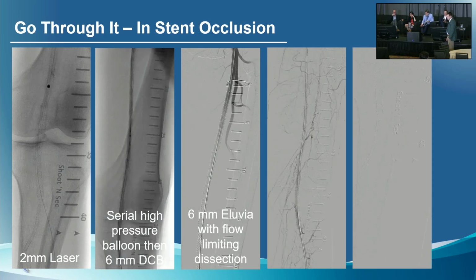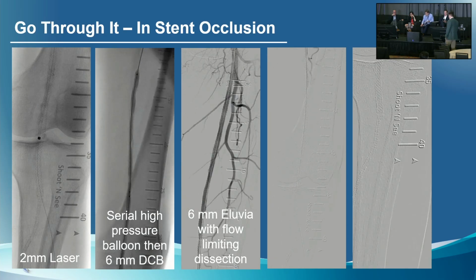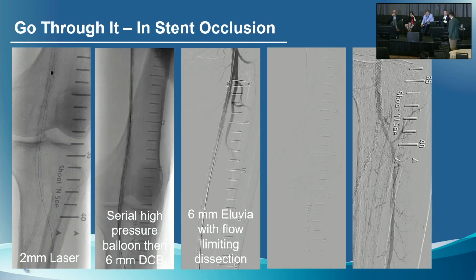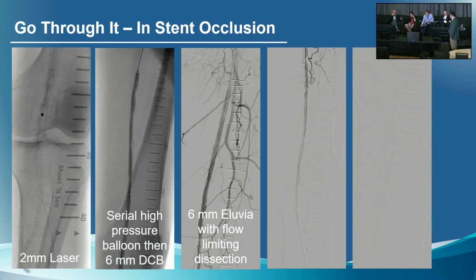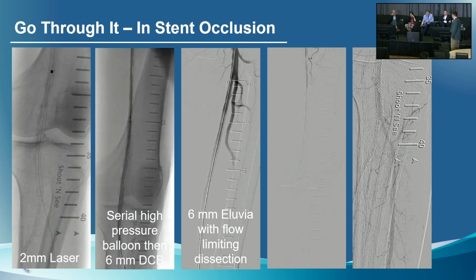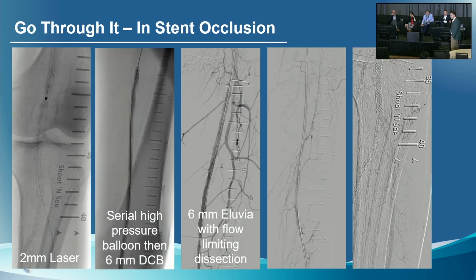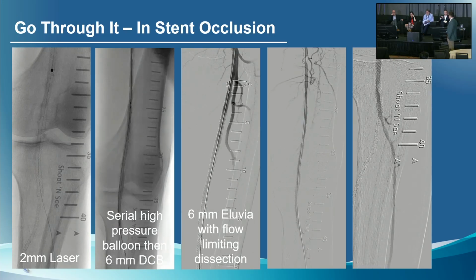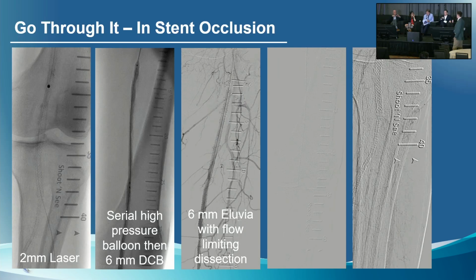She did go on to have demarcation of her wound and was able to have debridement, and so far has been progressing and healing in the way we would hope. So this isn't going to stay open forever, but hopefully it's going to not leave her with bilateral BKAs, is the goal here. Would anybody have done anything different here or used more aggressive techniques or different techniques?